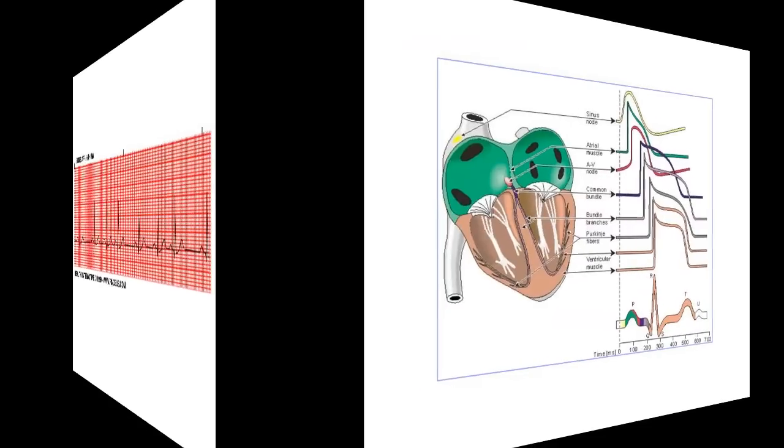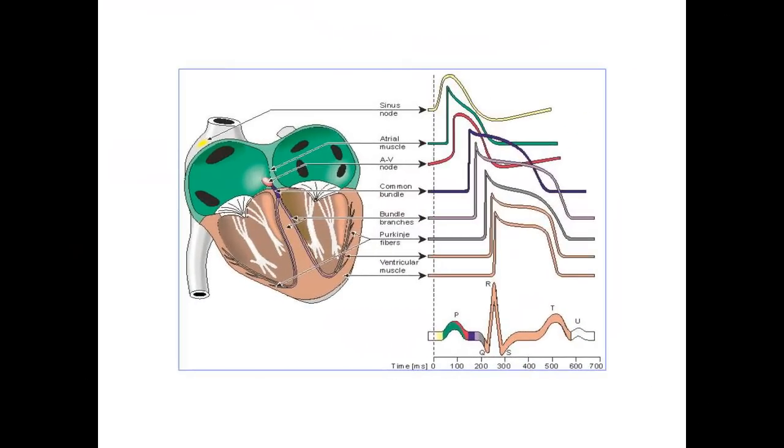So why do we use the R wave as our marker? Well, if we were looking at heart rate itself and we really wanted to get down to the roots of it, we try to record the sinoatrial node, but that's virtually impossible. The great thing about a heartbeat and the ECG it generates is that every waveform or every part of an ECG wave is the same distance from the beginning relatively than any other wave, and it holds from beat to beat, as in the P wave always goes first, and then you get the QRS complex, and then after a period of time you get your T wave, and so on and so forth.